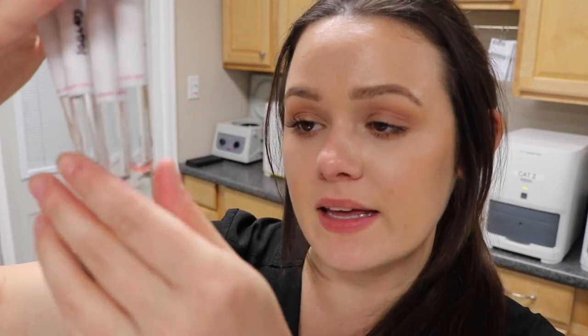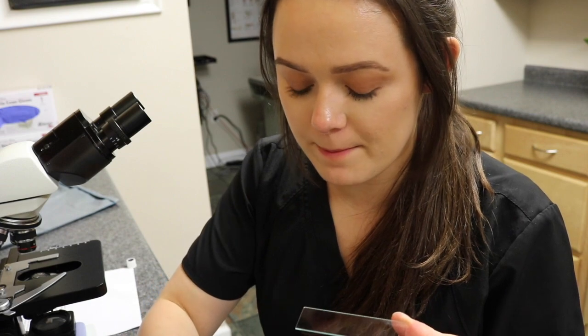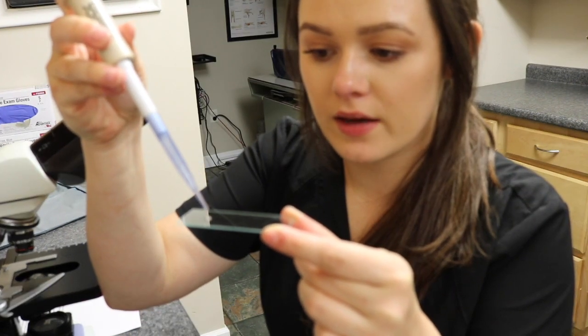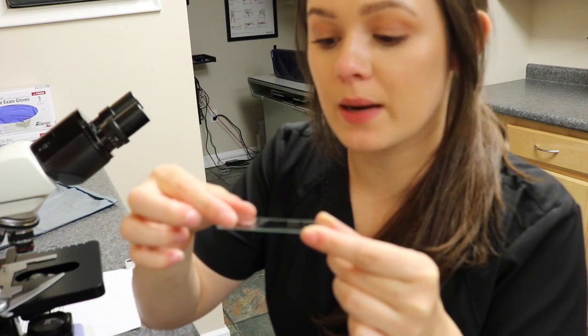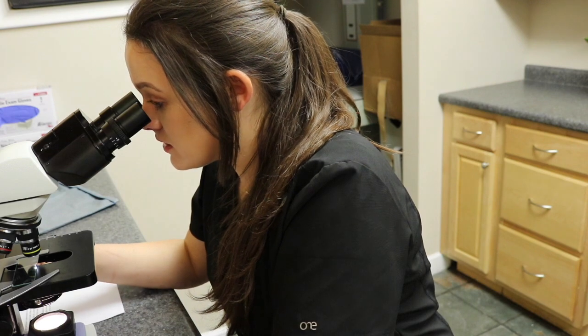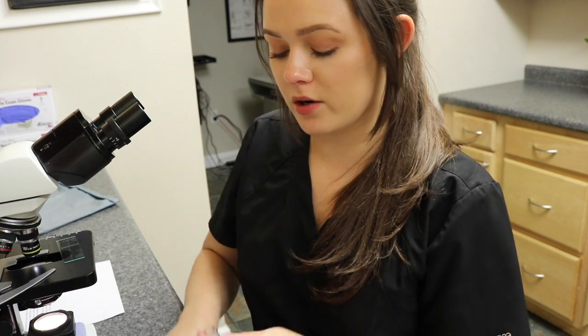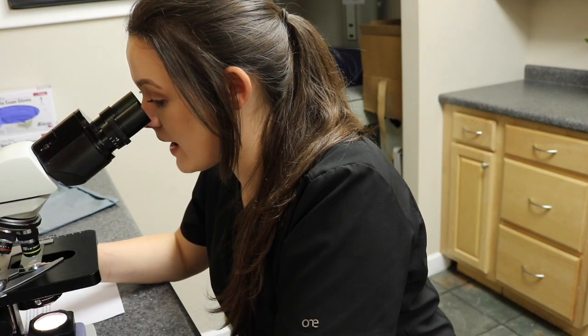After centrifugation, I don't see any hemolysis in the supernatant. I'll look at each sample under the microscope to check for agglutination. On the major cross-match, there are no signs of agglutination. On the minor cross-match as well, there is no agglutination. Since both the major and minor cross-matches show no agglutination, this means the donor and recipient are a compatible pair for blood transfusion.